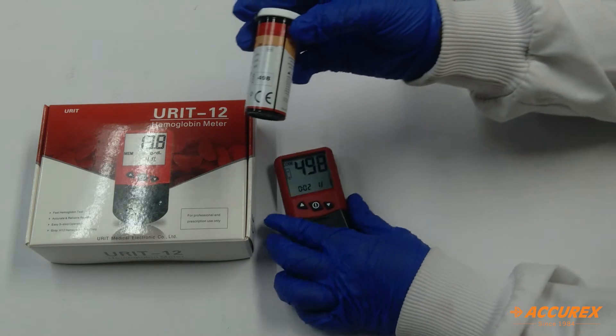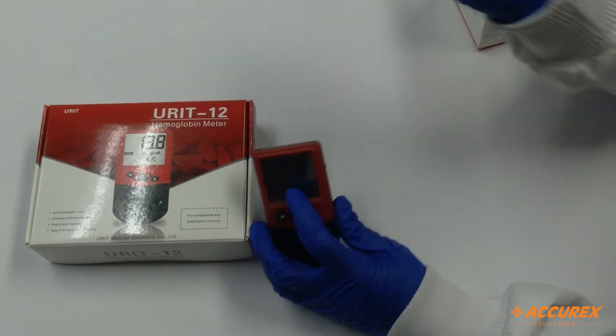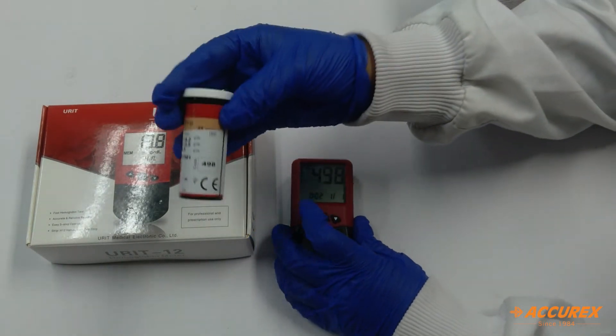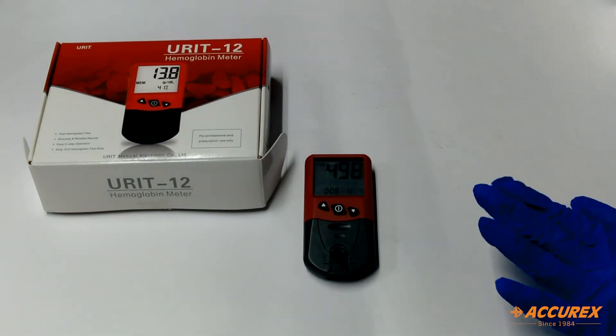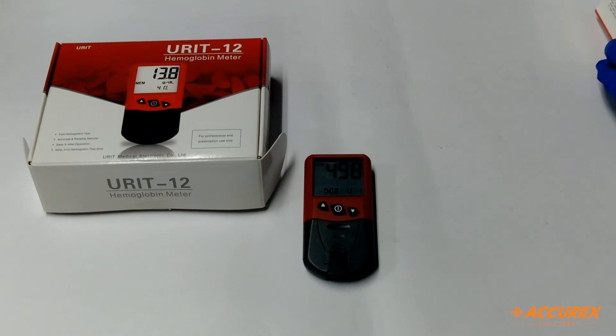For example, here the meter shows 498 and on this strip we also have 498. So after inserting the code chip, we will proceed further with the testing.